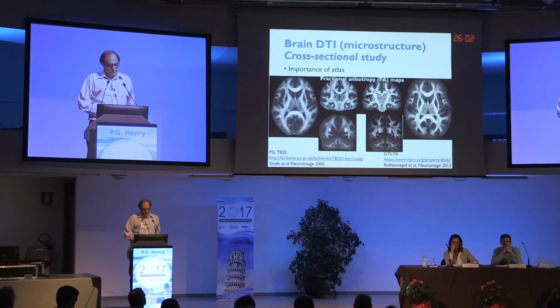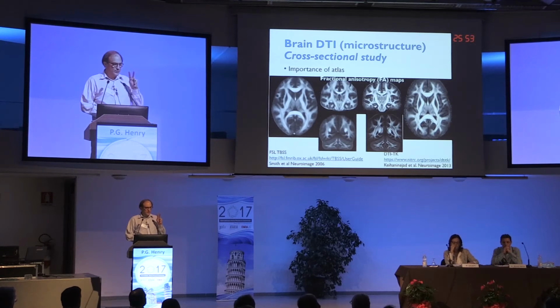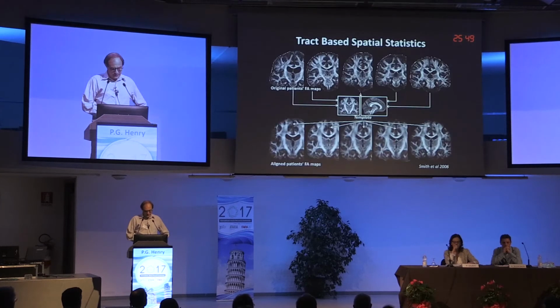So I'm going to start with the brain DTI. I want to emphasize the importance of the atlas, and particularly for this study, we created 2 separate atlases, one for control and one for patients. And then we did TBSS to assess the differences between controls and patients.